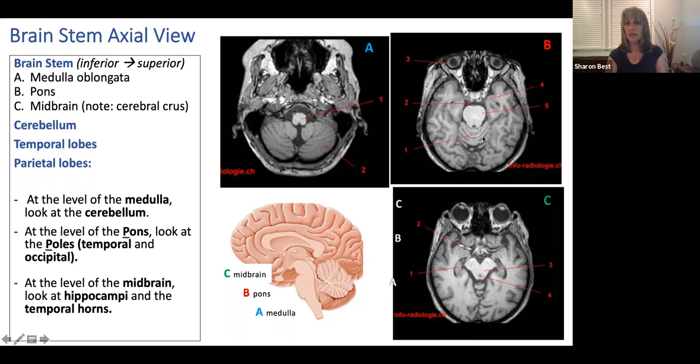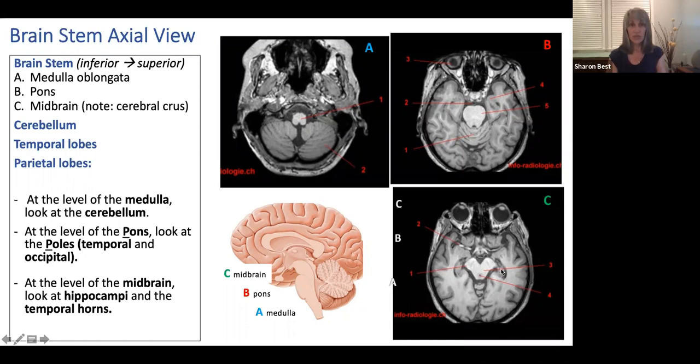As we continue to scroll superiorly, we'll see the brainstem change to the shape of the midbrain, which looks like a butterfly and is associated with the cerebral crura — large white matter tracks going to and from the cortex. At the level of the midbrain, we want to notice the right hippocampus and left hippocampus — medial temporal lobe structures very important to us in dementia.